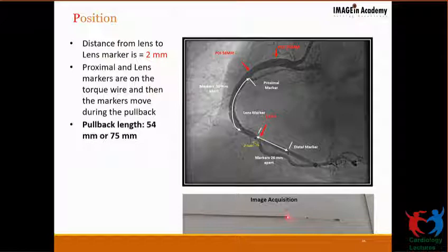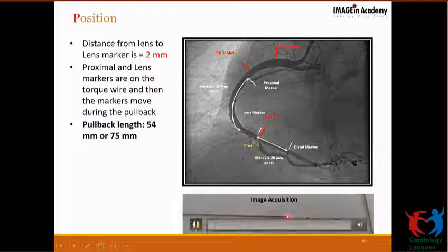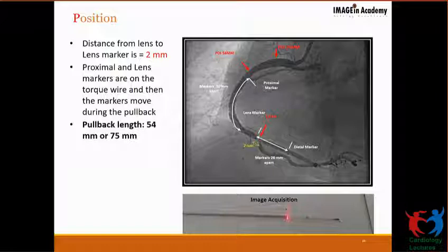In a typical setting, you have a guiding catheter in, and the vessel has been cannulated. You have the 014 wire across. And as I told you, this has three markers: the distal, the middle, and the proximal. The pullback is going to be from the middle marker backwards, and you have two modes in which you work with this catheter. One is a high resolution mode, and the second is the survey mode. Once you've initiated the pullback, the catheter spins 360 degrees on its axis and comes back. Once the complete run is over, the catheter will return automatically to its original position, as you can see happening on the slide.